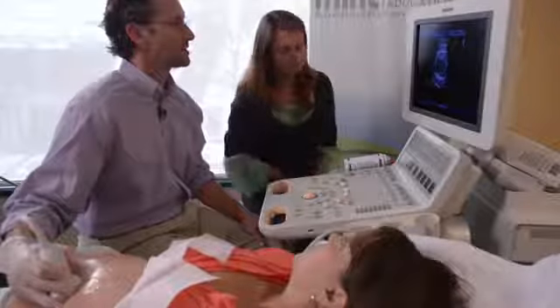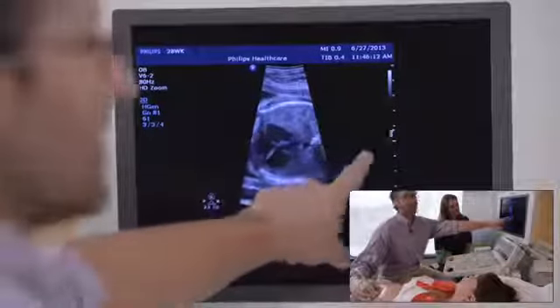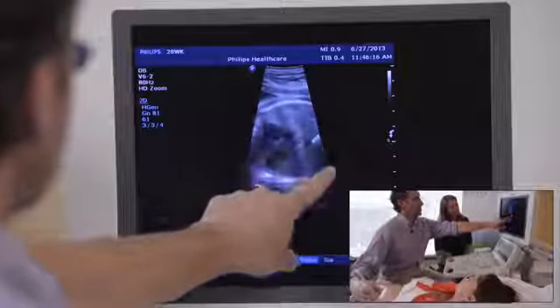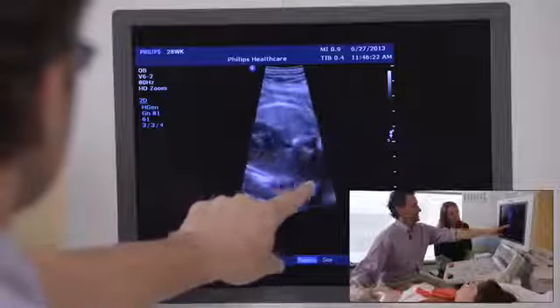and there's a few things we want to notice. First is the axis of the heart. So if you draw a line right from the spine, which is back here, shadowing bone, from the spine, sorry, this is a little bit tight.